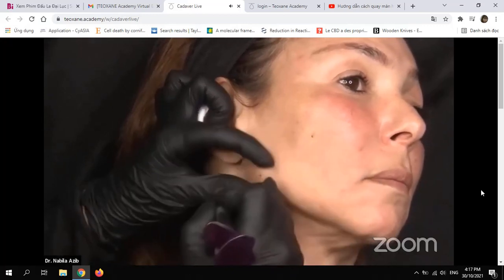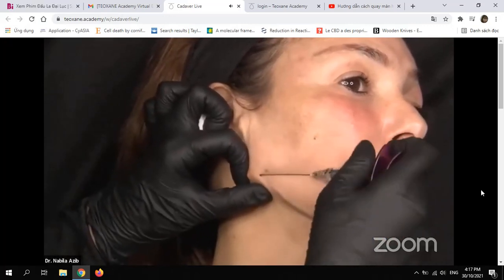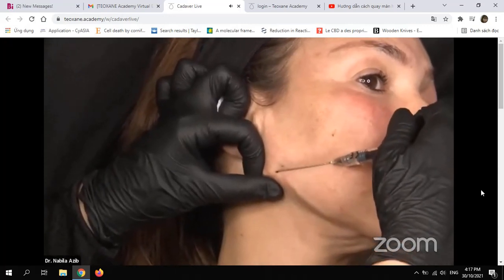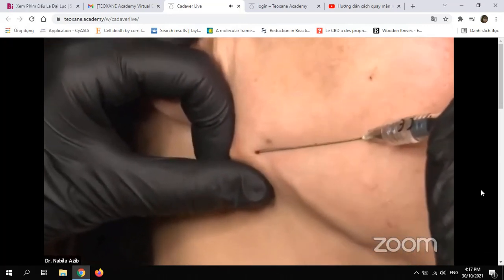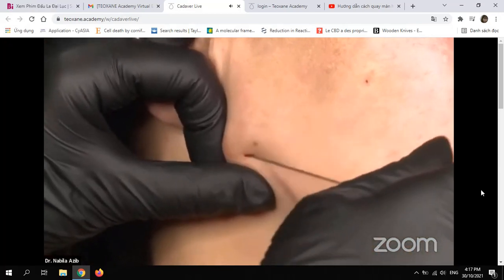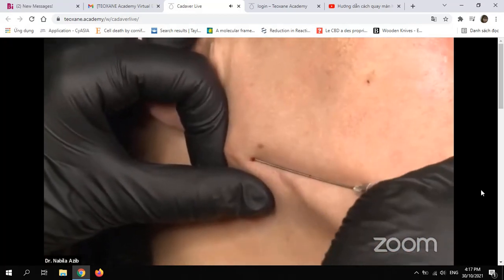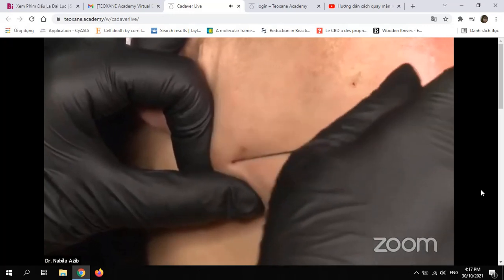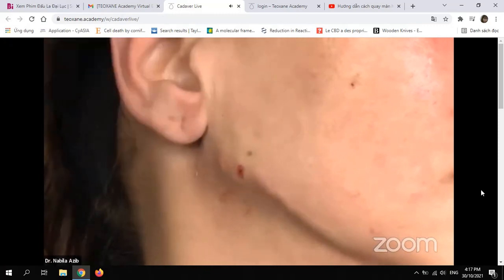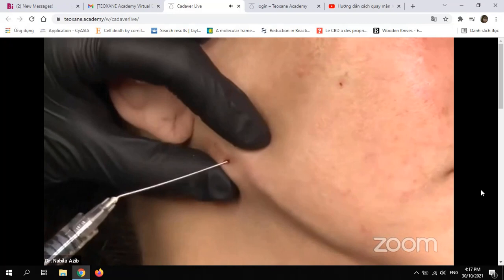You see that with the 22 gauge cannula, you cannot bend your cannula when you have a resistance. So look here, zoom in please. You are at subdermal level, yes? I'm at subdermal level, and I will do a short fanning technique, with my cannula kissing my finger. You see, I have to touch my finger to have this clear-cut angle at this side.